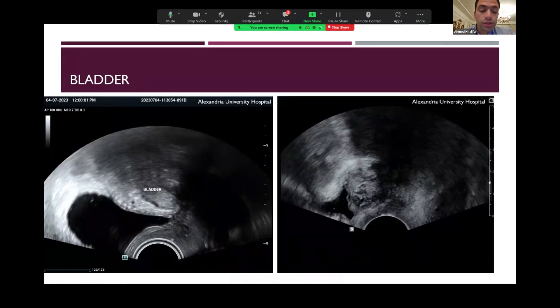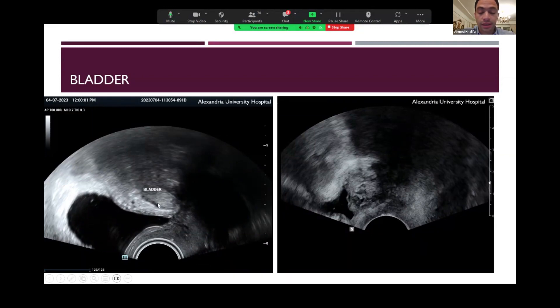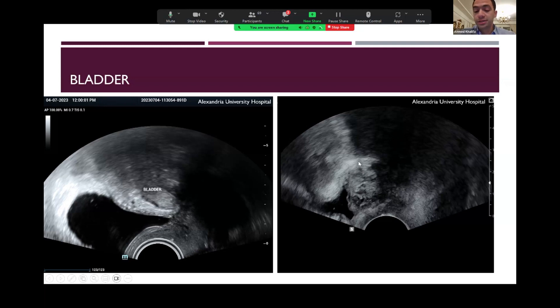We will shift to the anterior compartment, which includes the bladder and the ureters, and we also include the kidneys with the anterior compartment. We will trace the lining of the bladder — as we can see on the left picture, the bladder is smooth and the outline is regular. However, on the right side, you can see a heterogeneous irregular mass involving part of the dome of the bladder and the trigone. This patient was complaining of hematuria and pelvic pain, either with menses or outside her menstrual bleeding, and she underwent a partial cystectomy with improvement in pain and hematuria.